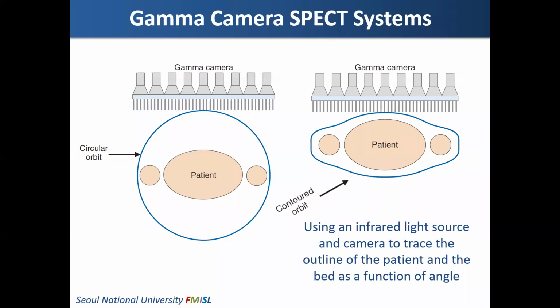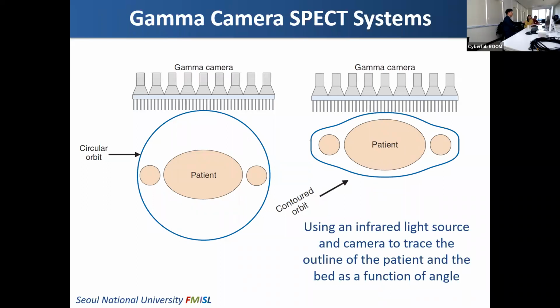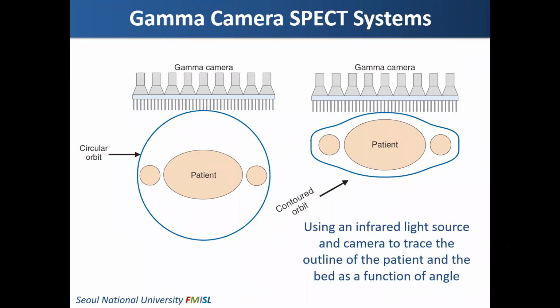I have read that they use slanted multi-pinhole collimators for cardiac. Actually, slanted is a little different from a pinhole collimator, but quite a similar concept.